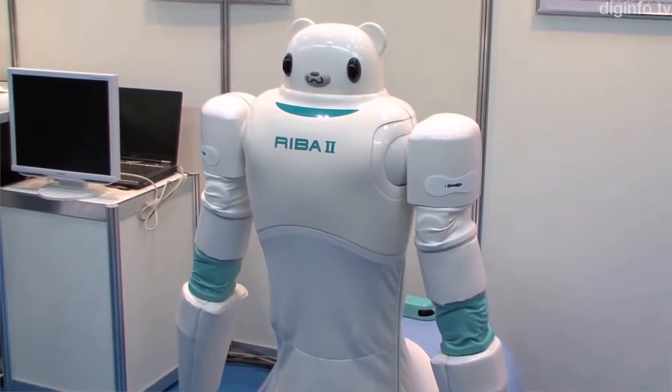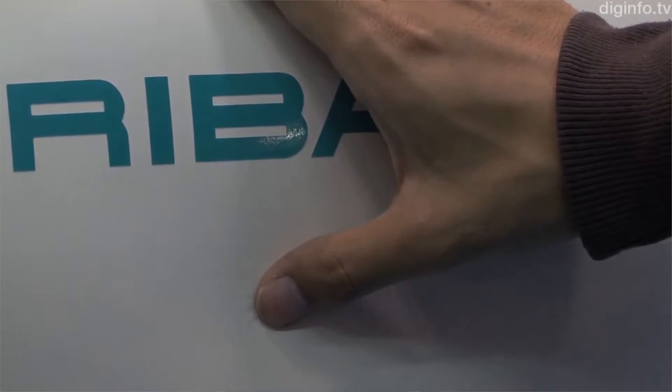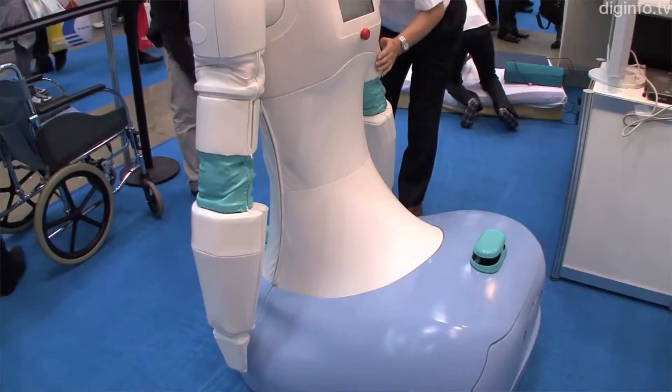New joints in the robot's spine and lower back enabled RIBA II to crouch down and lift a patient off a futon at floor level — the most physically strenuous task for caregivers, and one that RIBA was not able to do.